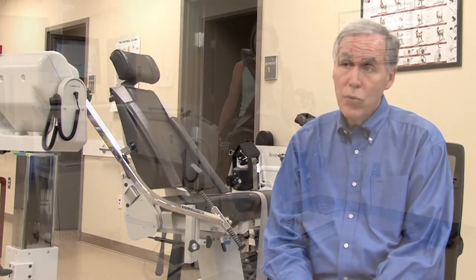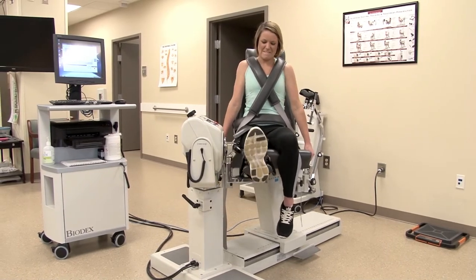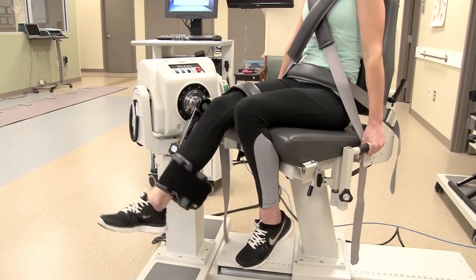The candidate goes through two sets of five reps on each extremity that's being measured. We have them go through a series of movements for both the left and the right knee, as well as the left and the right shoulders.